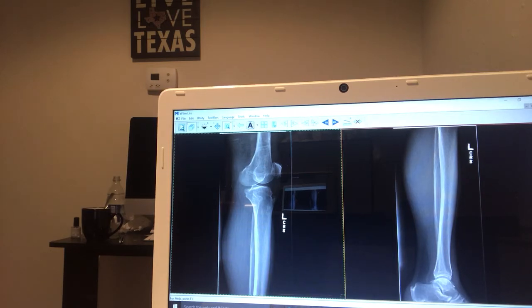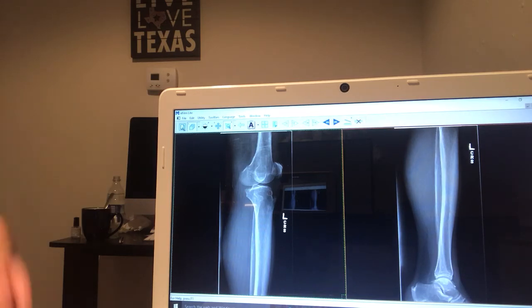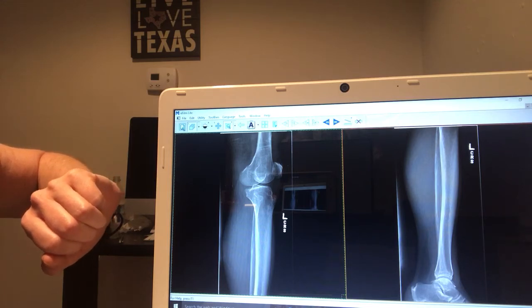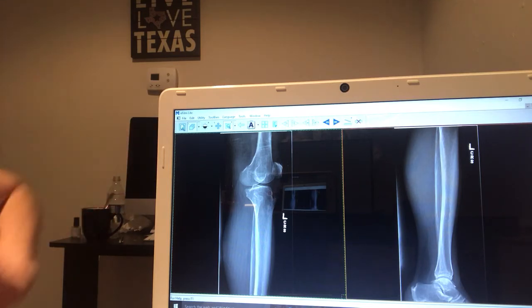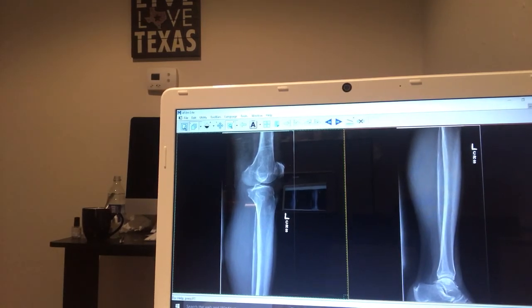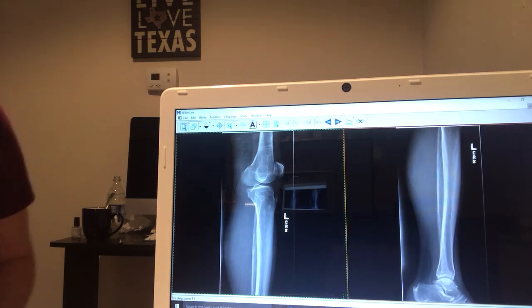I also did not remove the grid, but I think as far as there is still uniform brightness, and you can still see all the cortical outlines and bony trabecula. So the main thing here was rotation. The patient was not rotated laterally enough.